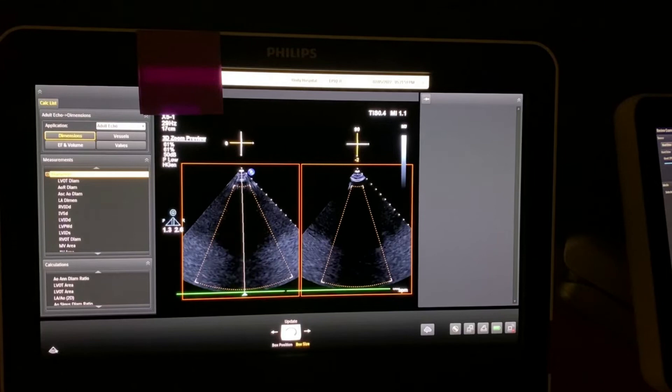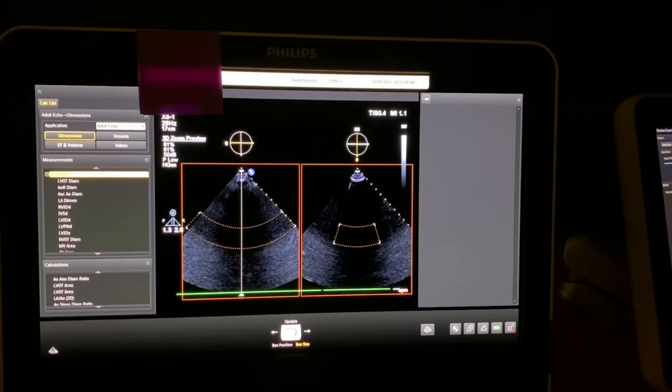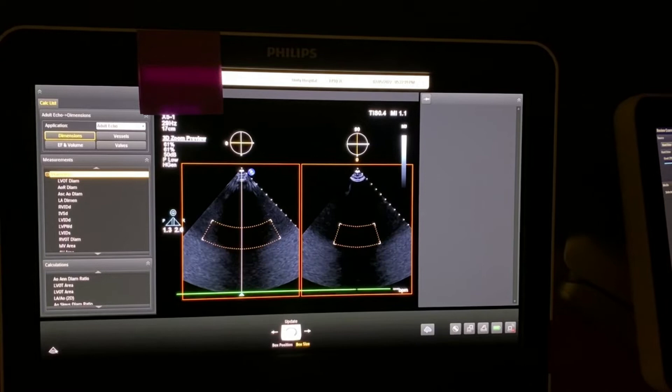Now it's box size. If you push away from you it makes it skinnier, and pulling the ball towards you makes it larger. Then left and right allows you to change the size of the box. Usually a mitral valve annulus if we're at a 45 degree view will look something like this.